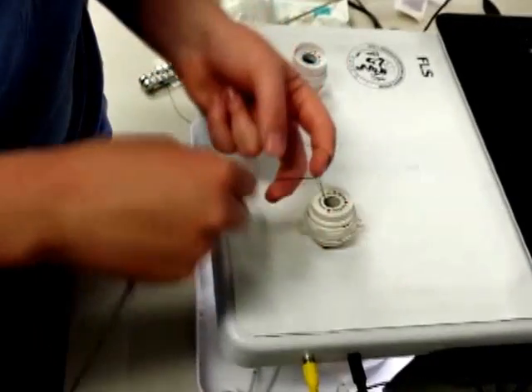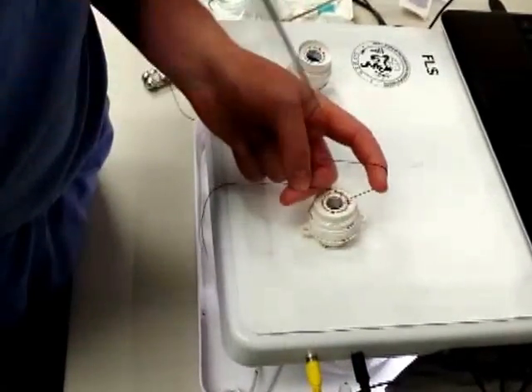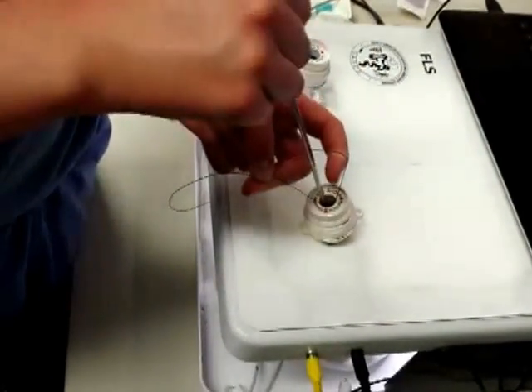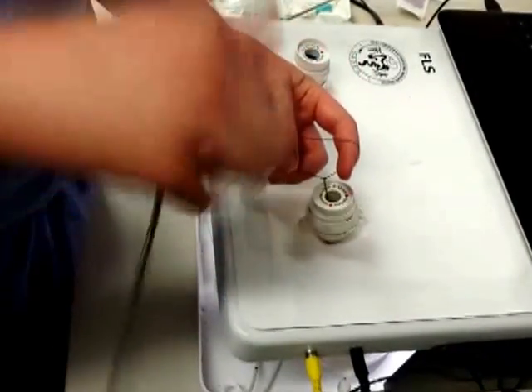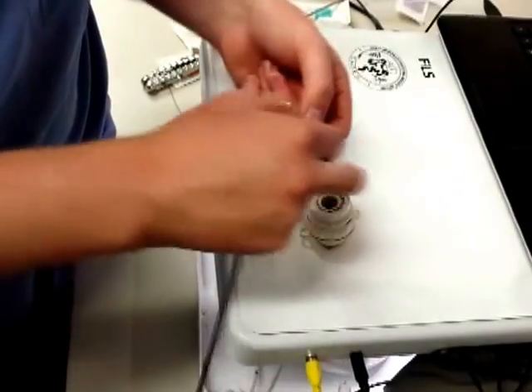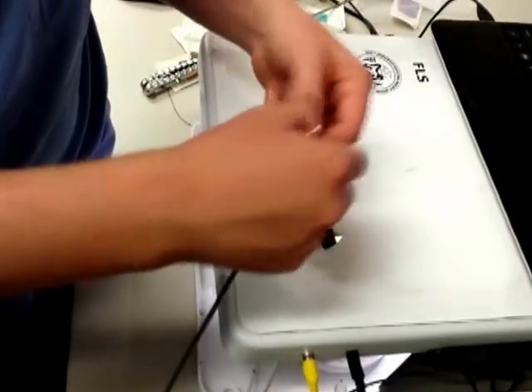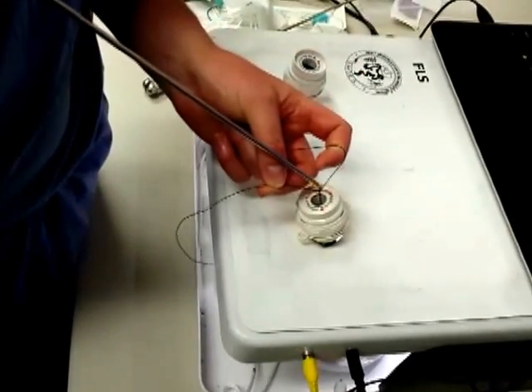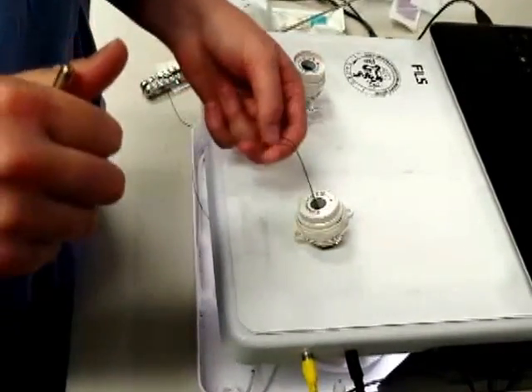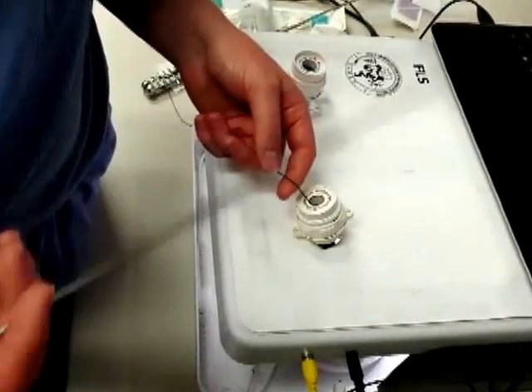If you are using a closed-end knot pusher as opposed to an open one, the closed-end knot pusher does not need to be removed from the suture with each subsequent throw. You simply need to use a one-handed tie technique instead of a two-handed tie to perform each subsequent throw. You can see here how a single throw onto the Penrose drain can be used multiple times to practice the rhythm of the extracorporeal knot tying. Once you've thrown three throws for the exercise, you would then stop, put the scissors in, and cut the suture to complete the exercise.